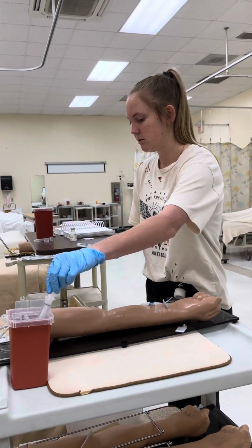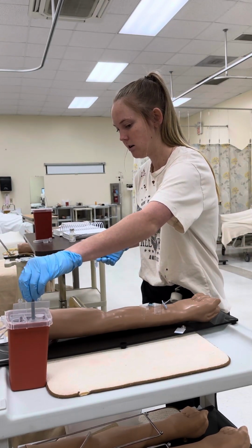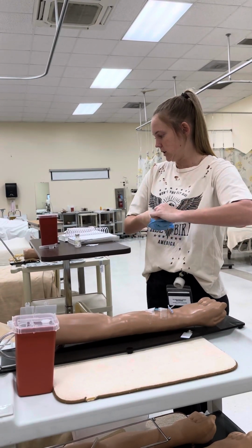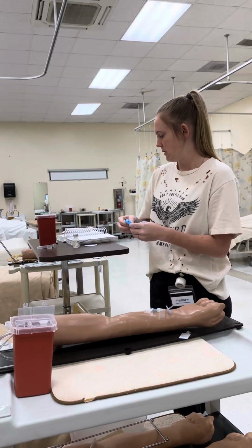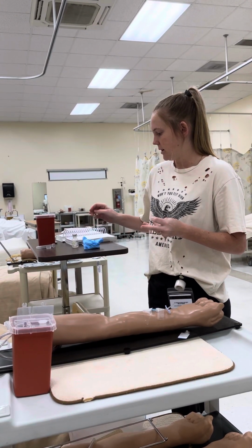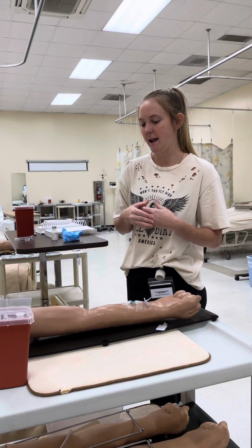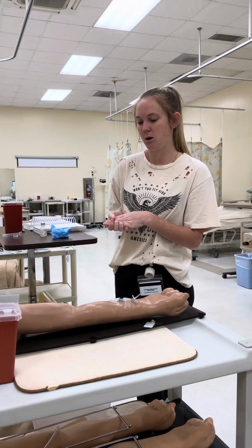I will then dispose of my syringes appropriately and also dispose of anything else that I have left here. And I will again make sure that the patient isn't having any adverse reaction to the medication, and then I will document appropriately.